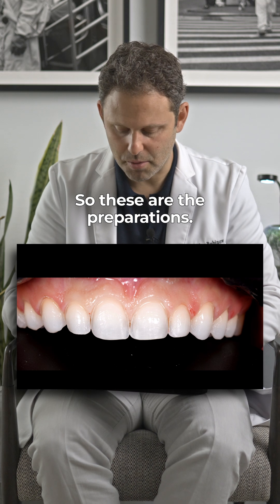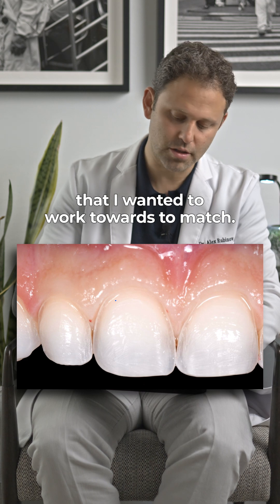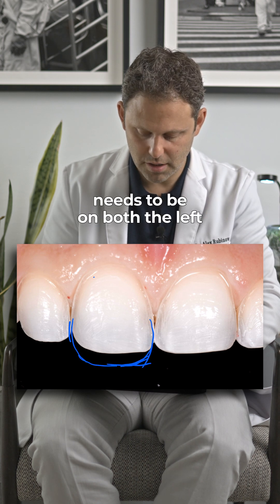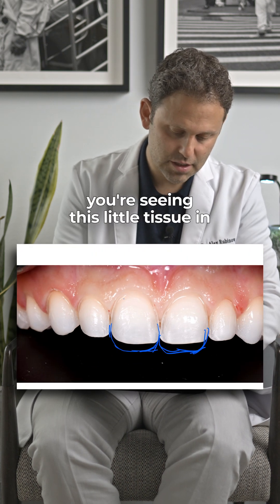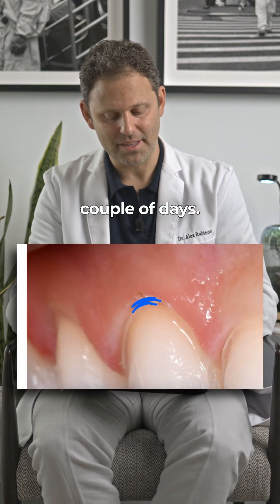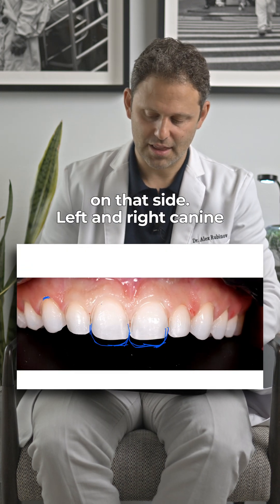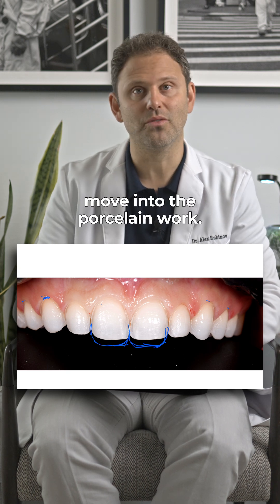So these are the preparations. This was the tooth that I wanted to work towards — to match the lengths of the left and the right, which are identical now. Once we come out of here, that veneer will be just what it needs to be on both the left and the right side. You're seeing this little tissue in this area because I raised it — that heals in just a matter of a couple of days, and by the time they come back with the temporaries, it looks perfect. I peaked the tissue on this side and on that side. Left and right canine positions are even. Left and right premolars are even. Now it's just time to move into the porcelain work.